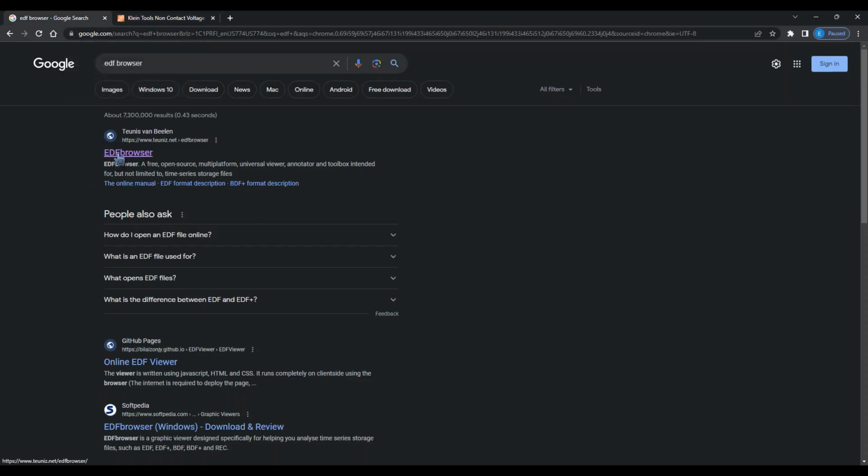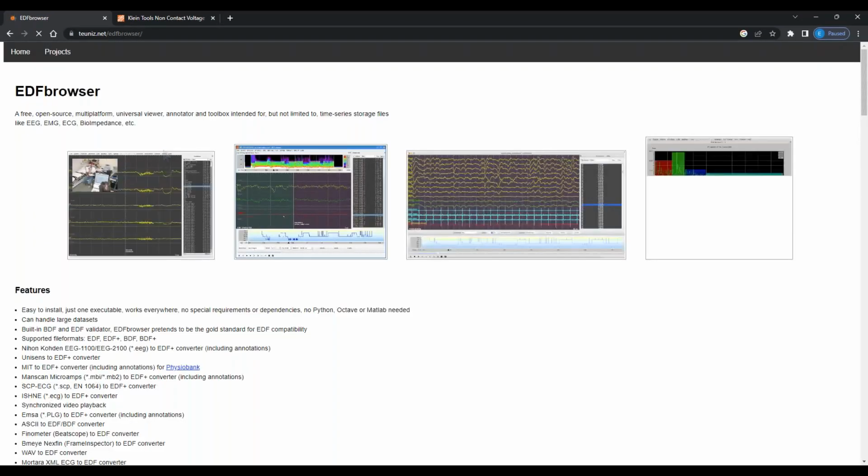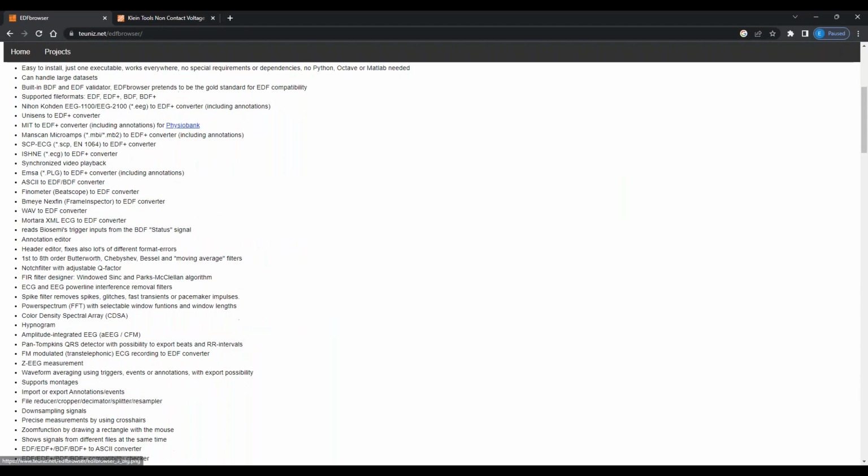So that got everyone thinking, do we want to spend the time and the energy finishing up the coding in the software to allow a playback, or do we just let that go? So you can save an EDF file from a training session and play it back, but currently not through the actual software.